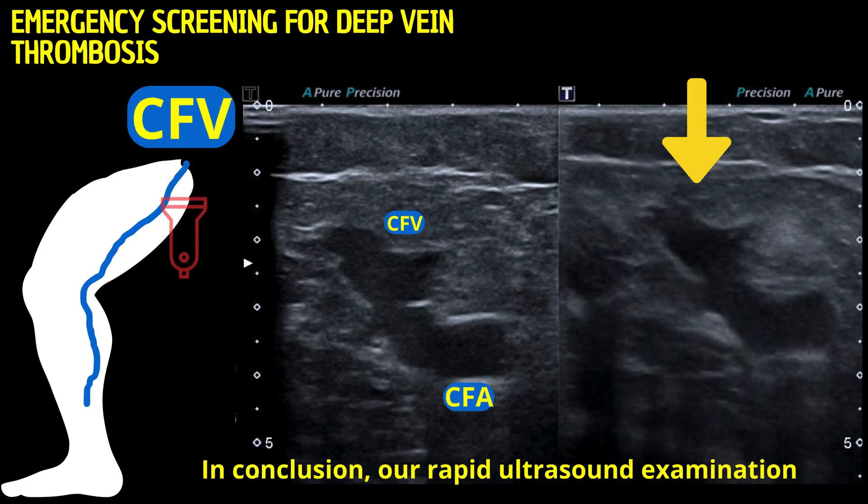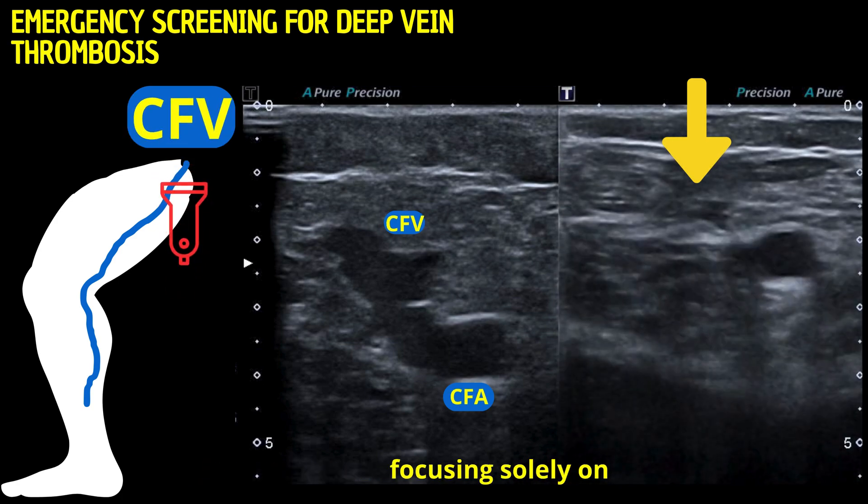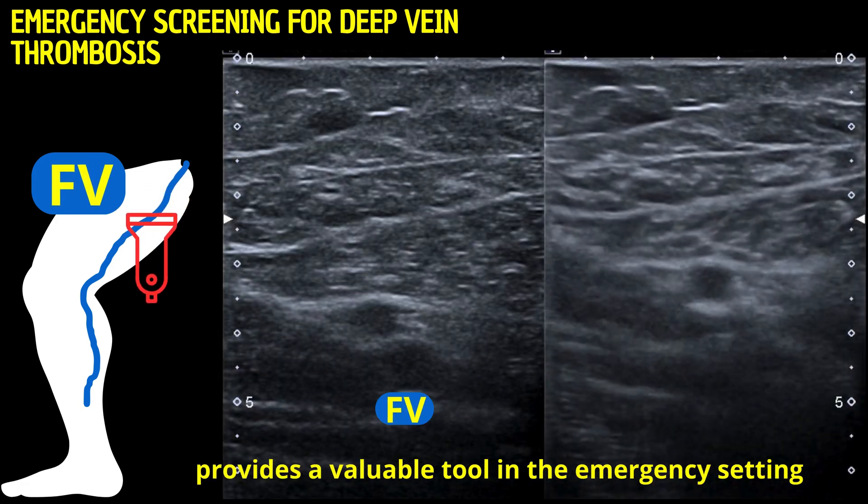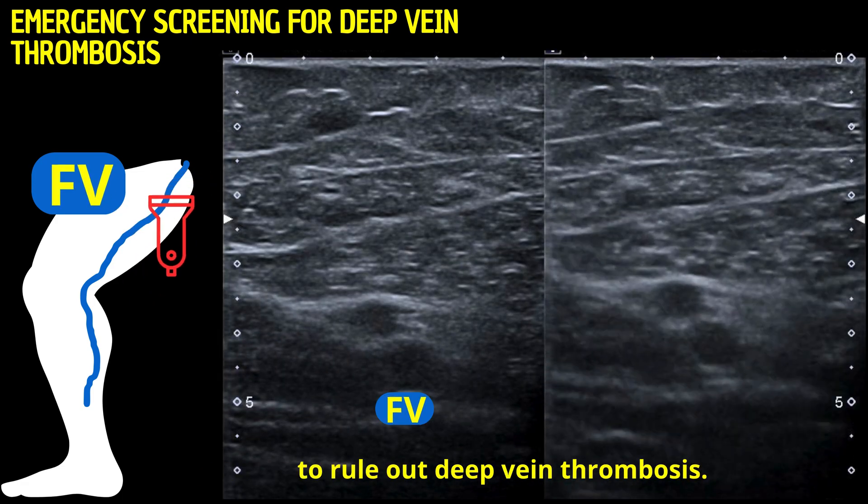In conclusion, our rapid ultrasound examination focusing solely on vein compressibility provides a valuable tool in the emergency setting to rule out deep vein thrombosis.